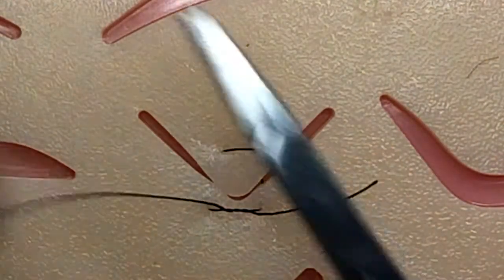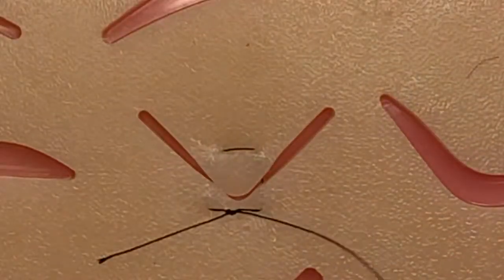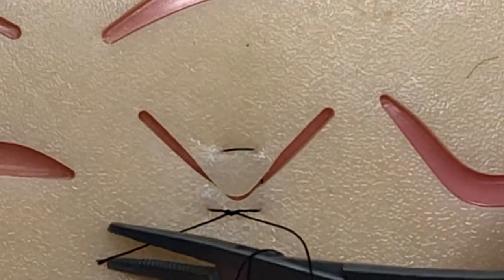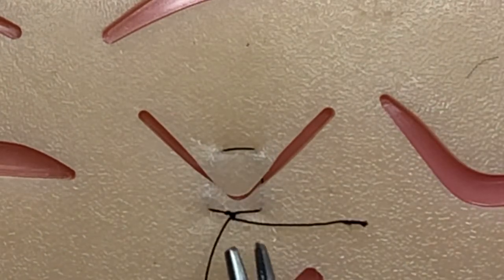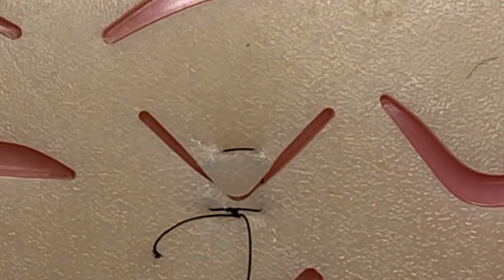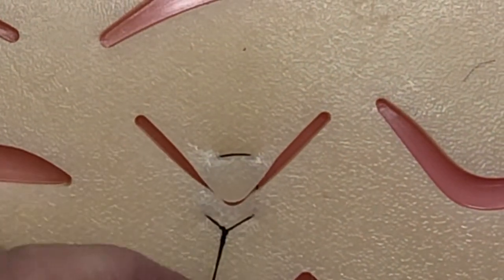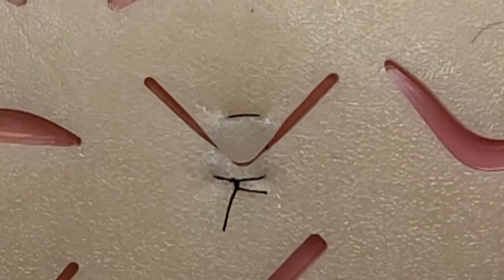So I've done my two-throw instrument knot there, and taking one throw and going across. Coming across. All right, so I've done a couple throws there, and now we can simply cut the thread.